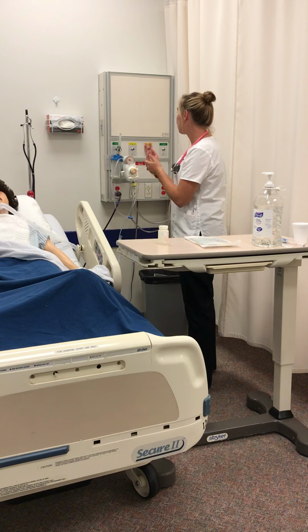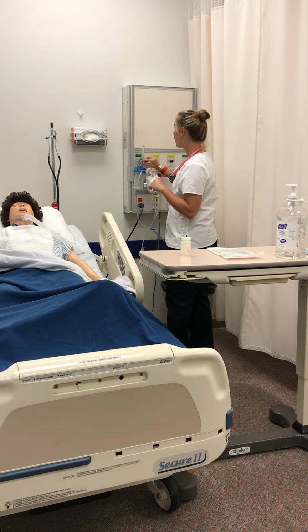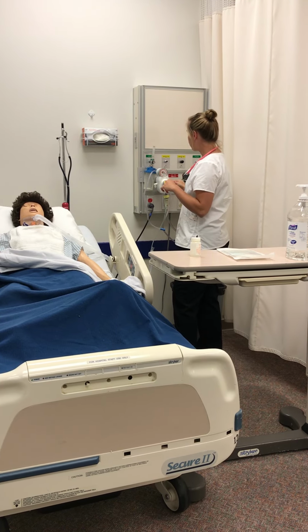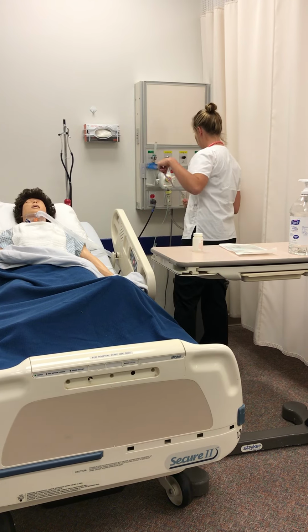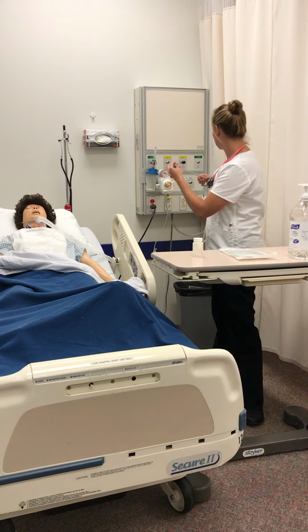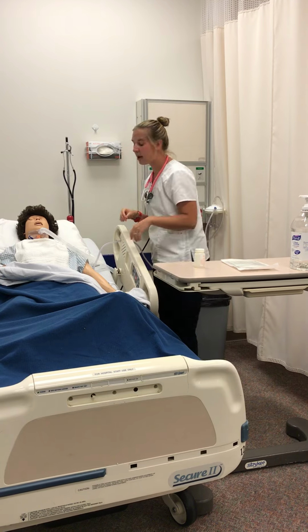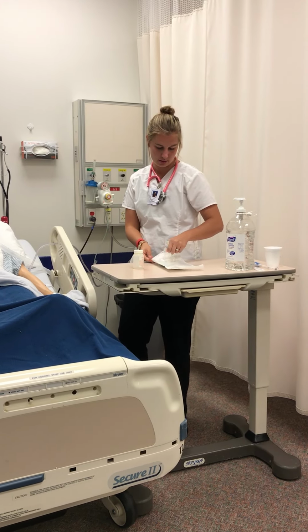All right, I'm going to increase your oxygen to about 100% more than what you're at right now. I'm going to hyperoxygenate you, take a couple of deep breaths, and I'm going to turn on this pressure. Go. All right, Gretchen, I'm going to lay that by you, okay? Keep deep breathing.